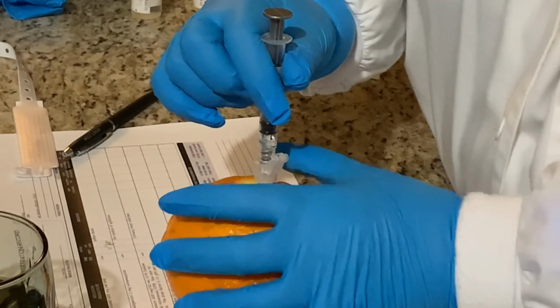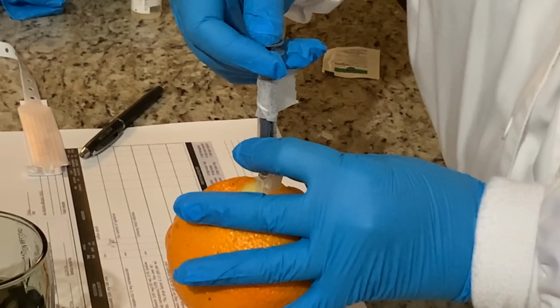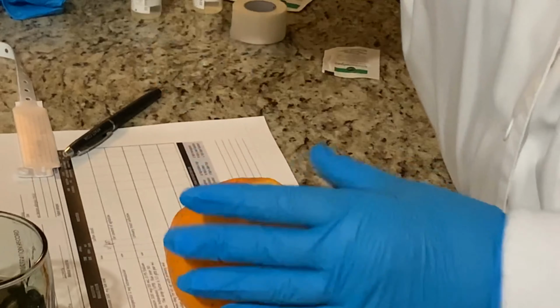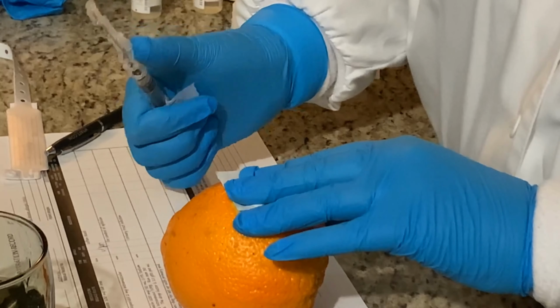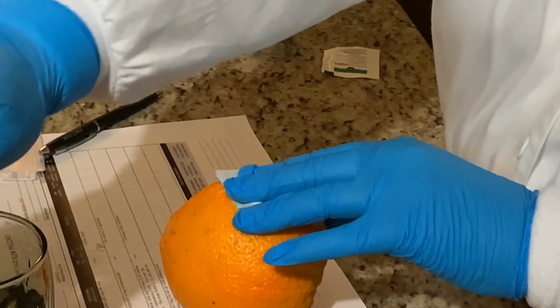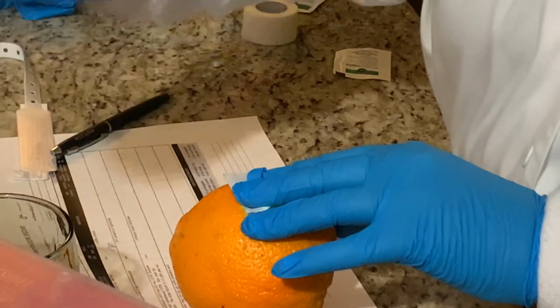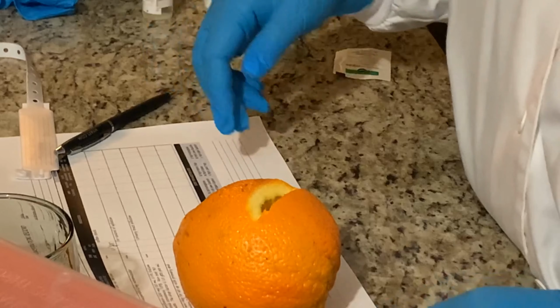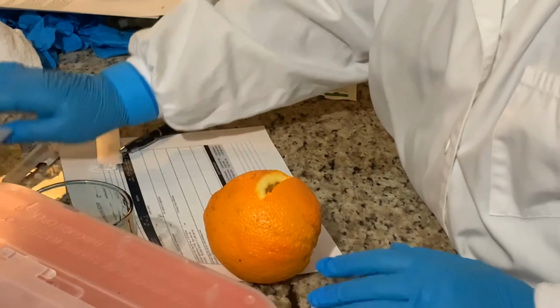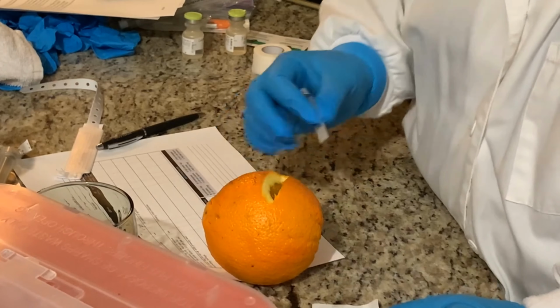I'm going to stabilize the syringe by holding it in the bottom half of the syringe. I'm going to inject it slowly. Pull it straight out. Apply pressure. Don't rub it. Put my safety on and put this in my needle box. And then I'm going to inspect the site, make sure it's not bleeding. If need be, I would put a Band-Aid on it, which is the Band-Aid that I have today.